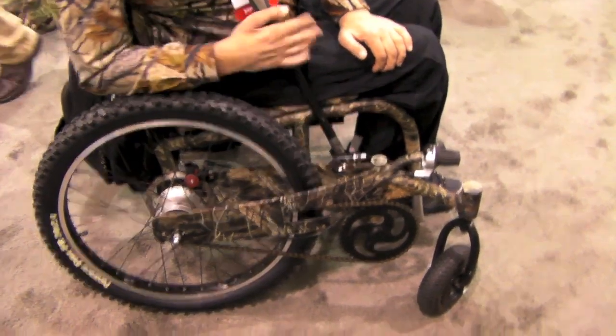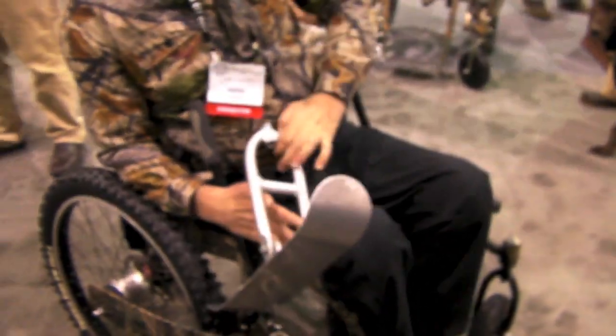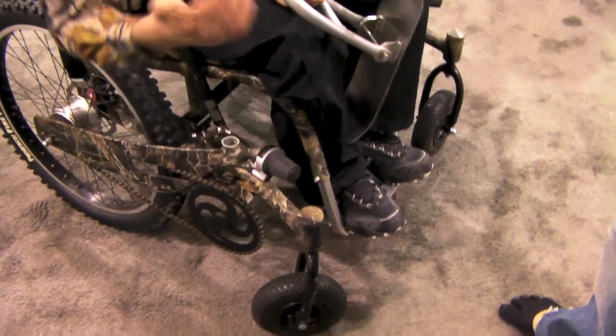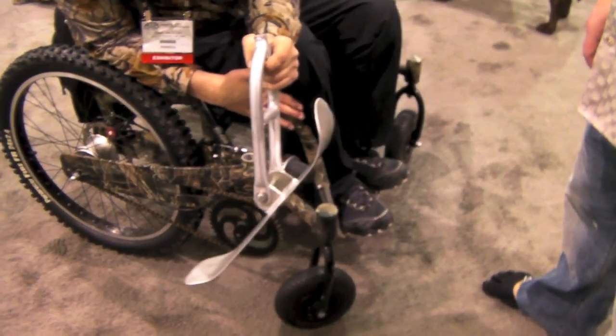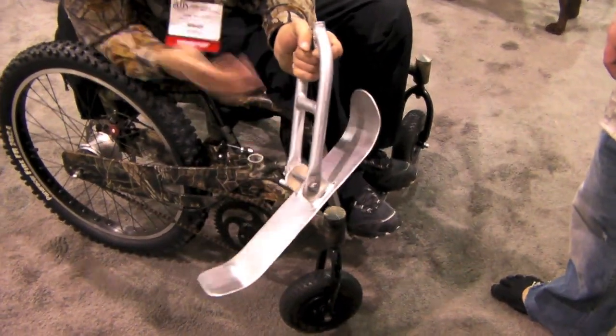There's chains that go on the wheels and there's also skis that attach. With these skis, you just take off this cap, this one nut — take the nut off, throw the ski on, and you're ready to go in the snow with the skis. It's very easy. It takes me less than five minutes, and I only have one hand at first.